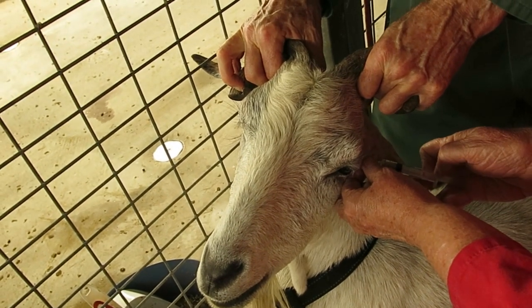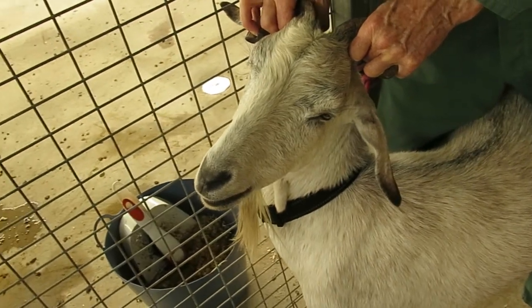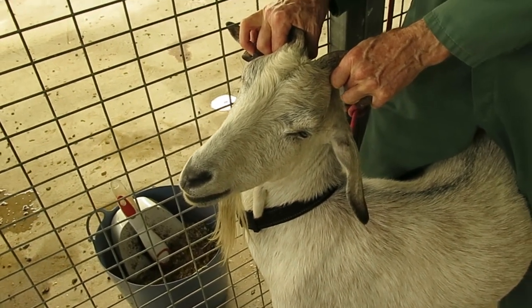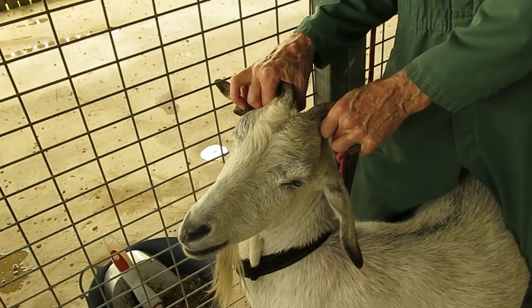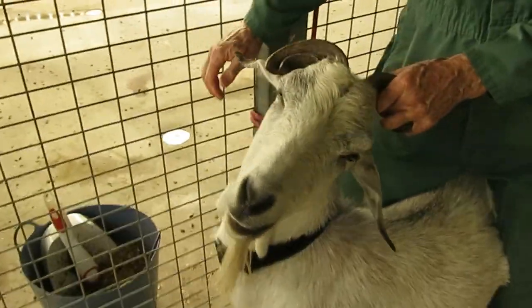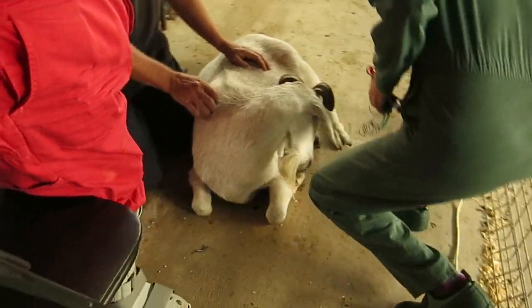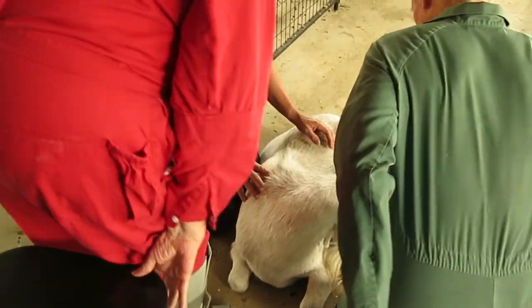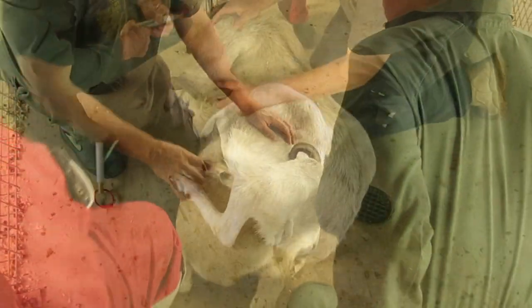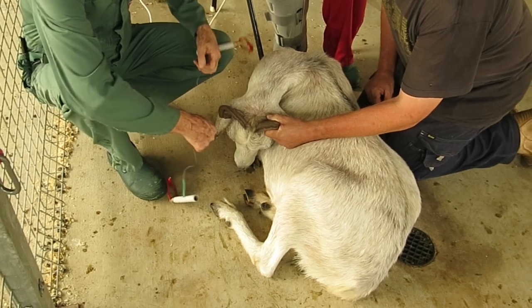Drawing back again to make sure I'm not in a blood vessel, and giving 2 ml of lignocaine. Now the goat is getting ready to drop — it is now deeply anaesthetized. Its respiratory rate has slowed from the pre-anaesthetic rate of 28 per minute.